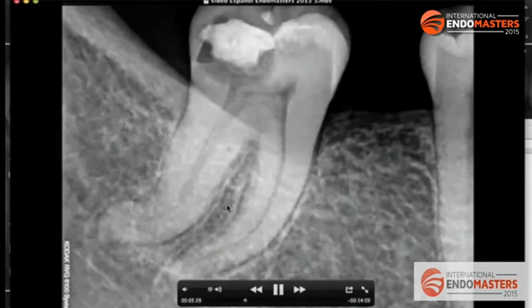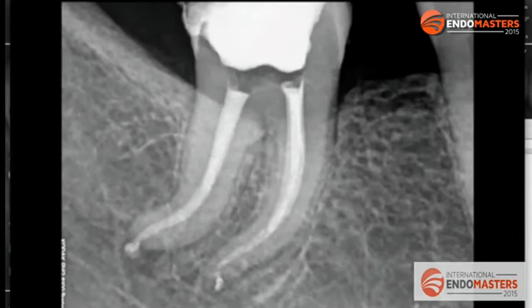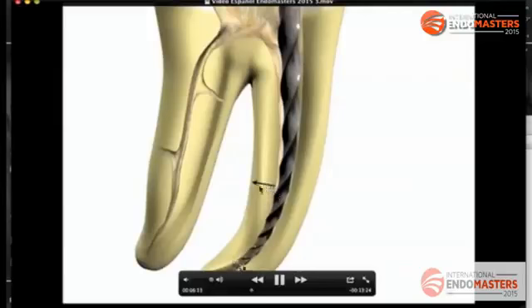Here we can see a tooth, and we can do a treatment perfectly without much effort with a few files. Now we can do a good shape to create a great taper to do a nice treatment. Here we have the file at working length, and because of the shape memory, it is always trying to get straight, so it is making load against the exterior of the curvature and also at this point.